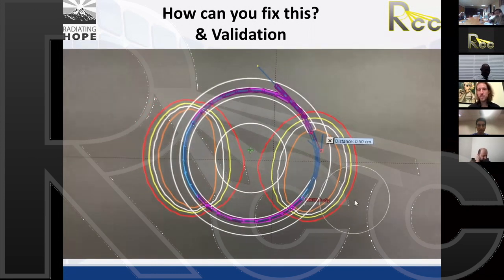Okay, so this is a very confusing thing for everybody, no matter how experienced you are as a physicist. So again, I strongly urge that whichever approach you take, you run your delivery plan. So you make a plan that you think in a patient will be symmetric. Whichever method you choose, run that plan in your applicator with film attached to it and make sure that it is indeed symmetric on your film. Okay, so that's the best way to ensure that there's no confusion that you've done it properly.